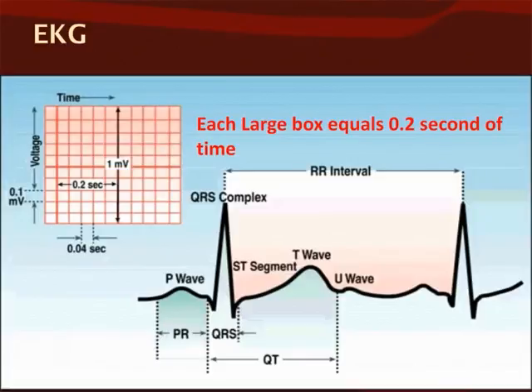So the ECG complexes measure the electrical events, whereas the paper measures the time. The ECG paper rolls out of the machine at a preset speed of about 25 millimeters or 1 inch per second. The paper is marked off in a grid with each line 1 millimeter apart, so every fifth line is darker and thicker so that the very small boxes can be counted accurately.